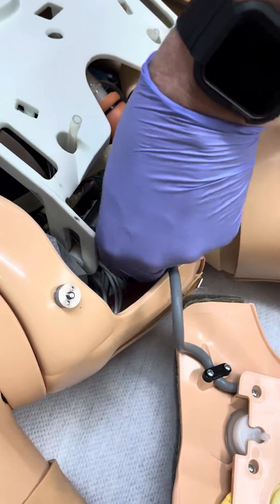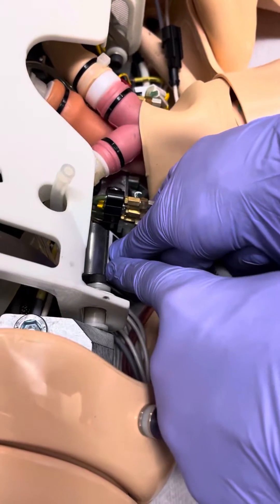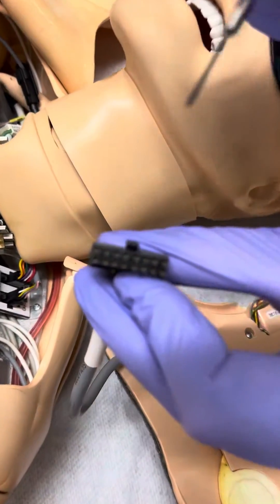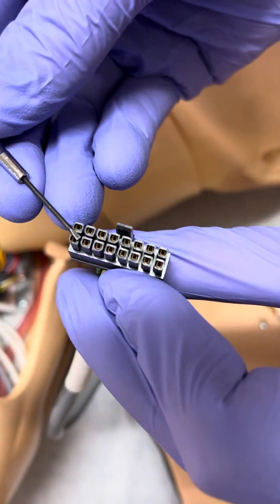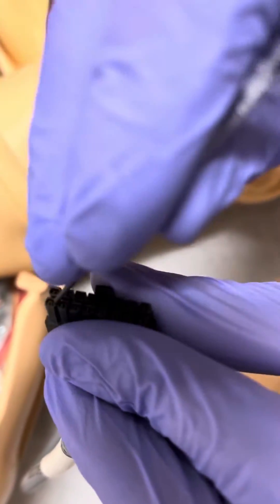Then we're going to push on the tab here — it's a little bit hard to do — and then we're going to tighten the connections in here. There's a gold square contact essentially in here, and all we're going to do is slide the screwdriver on the same side of each one and close the connection.